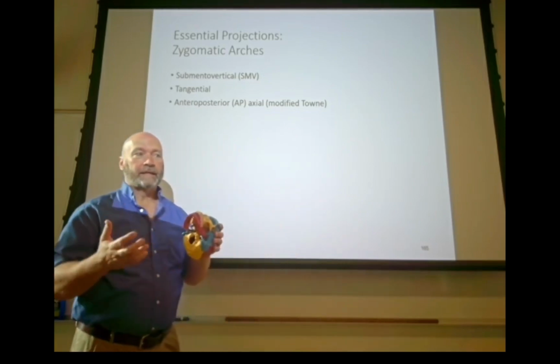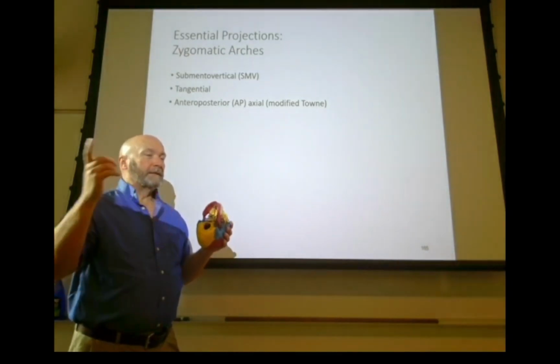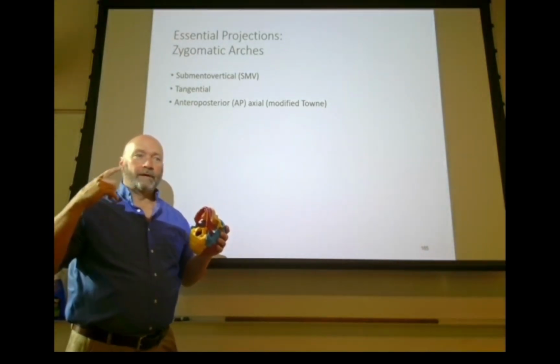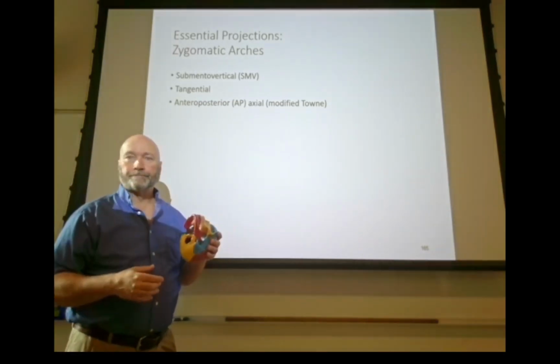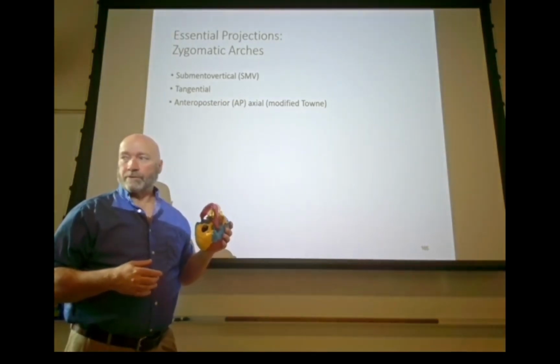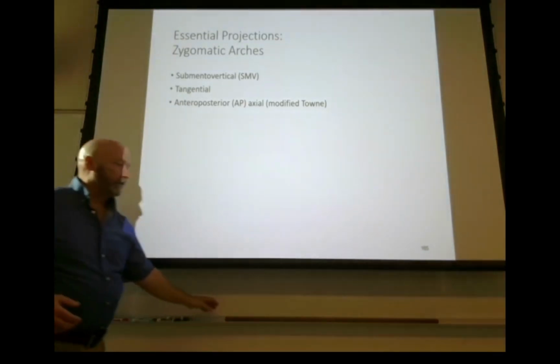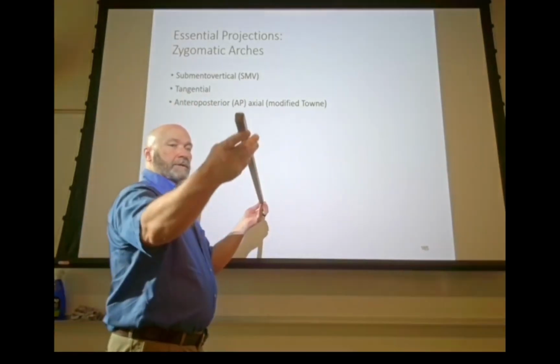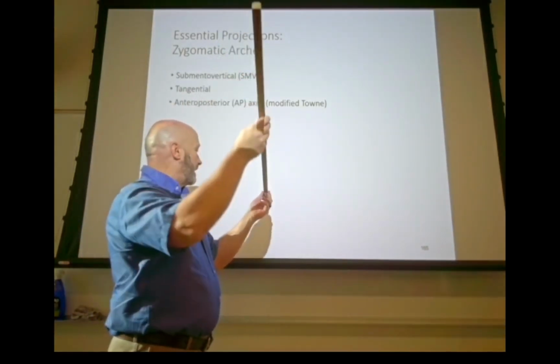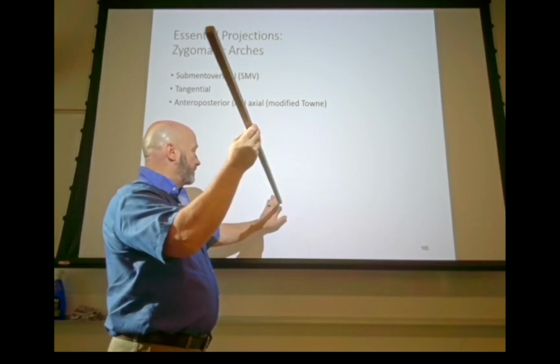But what you can do to project these out and away from the top of the skull is to take advantage of the divergence of the central ray. So does the central ray diverge more at closer SIDs or further? Closer. You have a wider angle at shorter SIDs. If I'm using this full length here, the divergence of my central ray is not going to be very great, right?